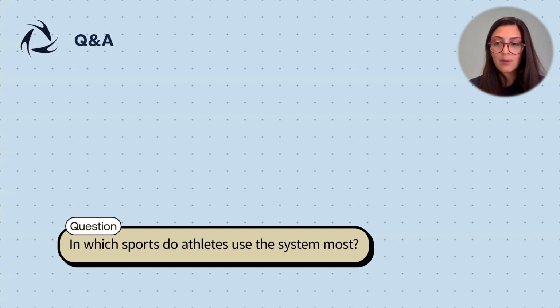If we talk about, for example, the Baiobit, the jump tests can be helpful in basically any sport. Jumps are able to evaluate the reactivity or the elasticity, so the power developed while doing the jumps. So basically, it can be used for training for any sport.